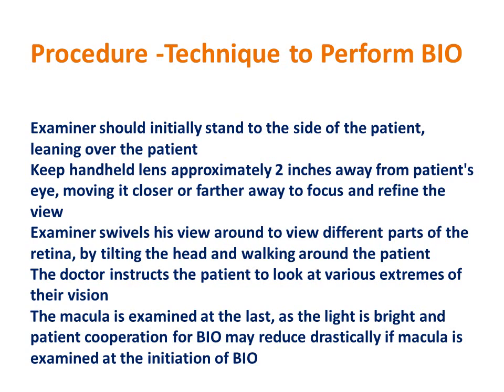The examiner then swivels his view around to view different parts of the retina by tilting the head and walking around the patient. The doctor instructs the patient to look at various extremes of their vision so as to visualize the posterior segment properly. The macula normally is examined last as the light is bright, and the patient's cooperation for BIO may reduce drastically if the macula is examined at the initial stages of binocular indirect ophthalmoscopy.